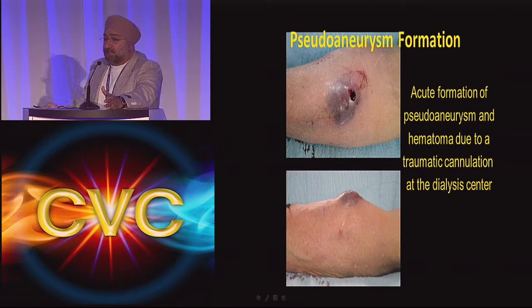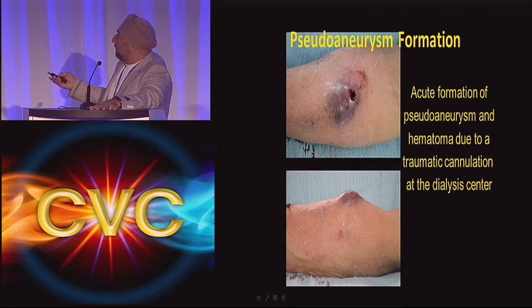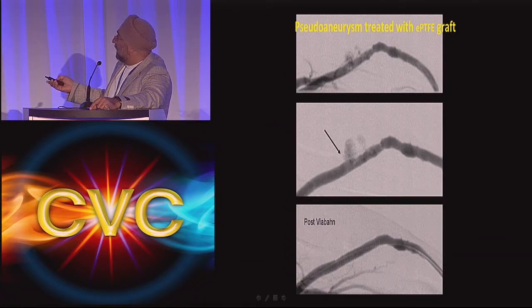The other advantage of stent grafts is for pseudoaneurysms that occur. You can actually place the graft on the inside and then exclude this, because you can imagine this rupturing, and I've seen them rupture in the lab. And you actually get through, there's the pseudoaneurysm contrast going on.